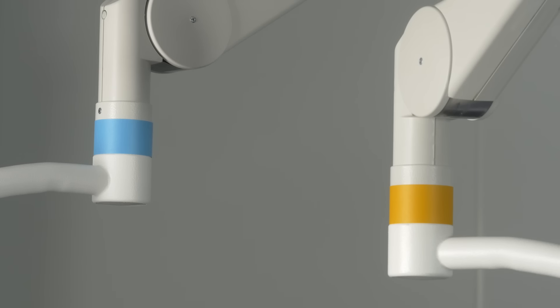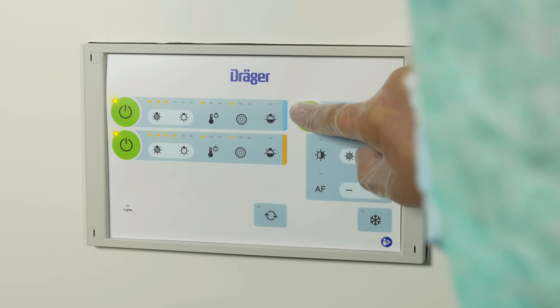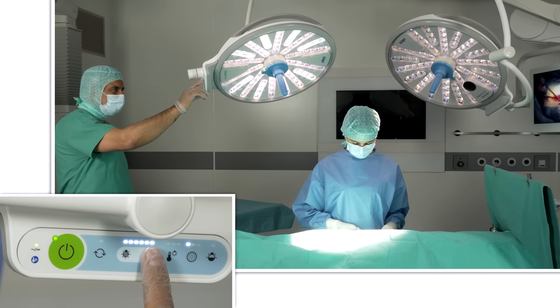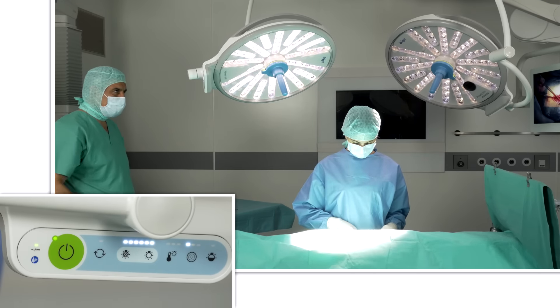The color markings above the light head and on the wall-mounted control panel and the intuitive front panel, also with touch technology, facilitate the operation of the light by non-sterile staff.